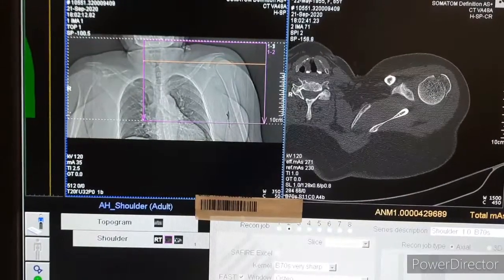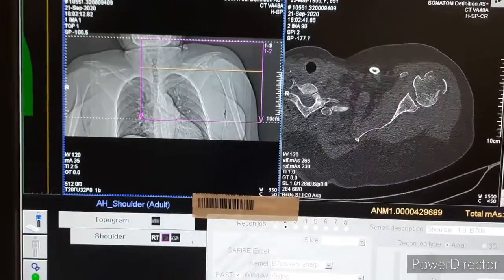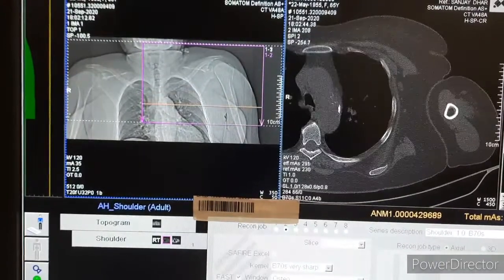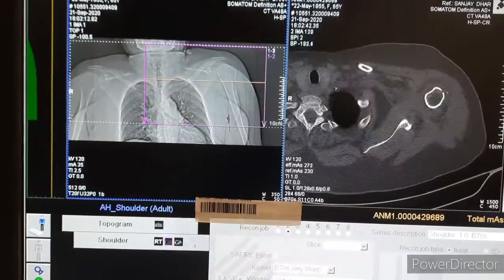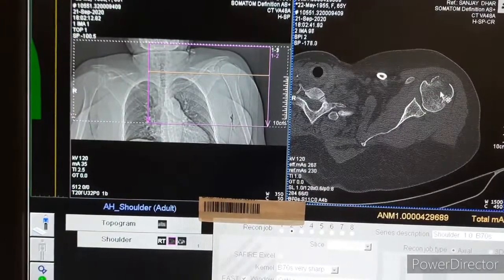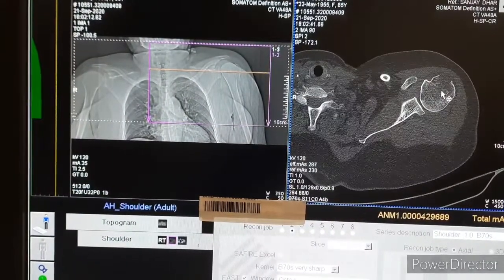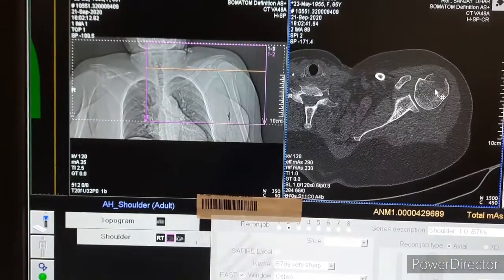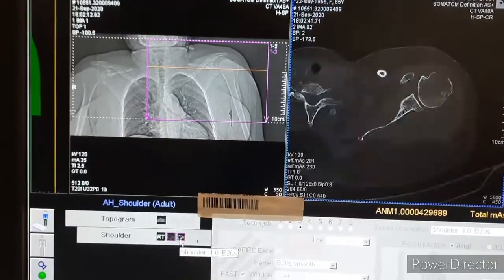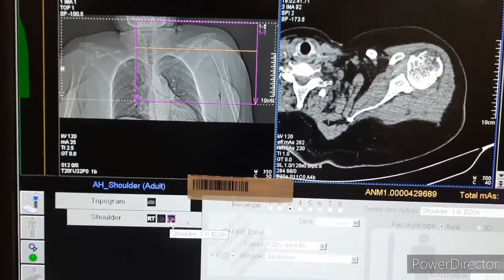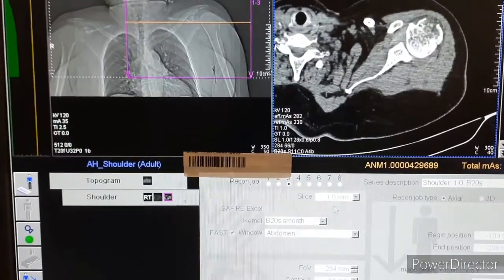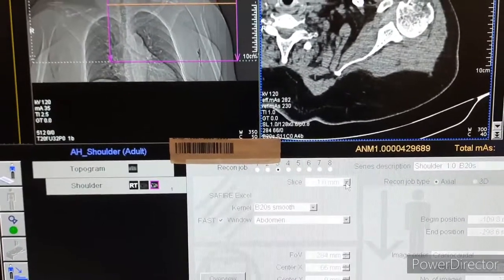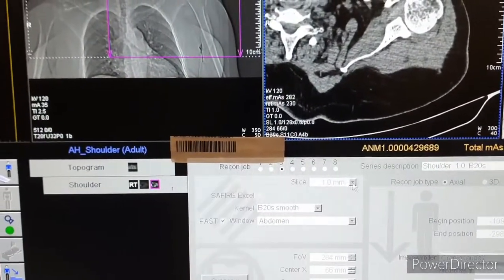You can see the coverage and the fracture at the head of the humerus. Next, you have to take a reconstruction. For 3D reconstruction, you need soft tissue with the same slice thickness and same gap.